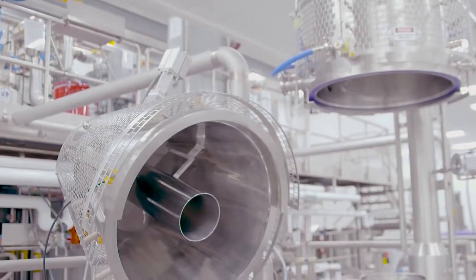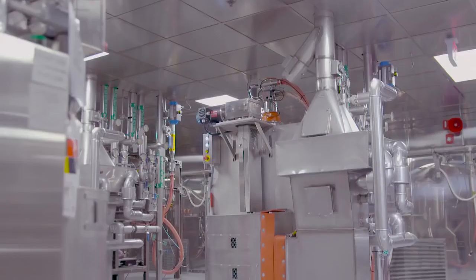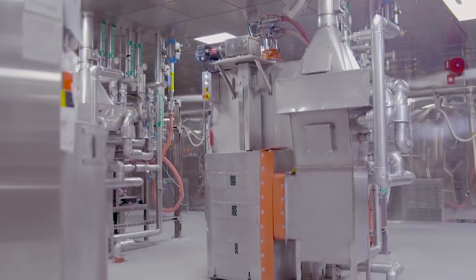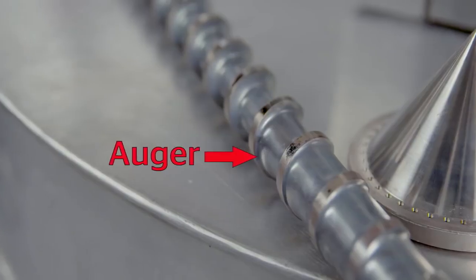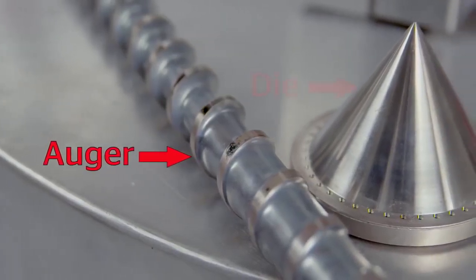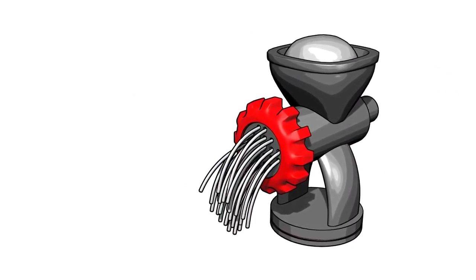Until now, nothing we've seen remotely looks like a thread. Extrusion is when the materials take shape, literally. First, the polymer pellets get shuttled downward through a vessel called an auger, which delivers them to a die that will extrude the polymer into fibre, similar to making spaghetti.